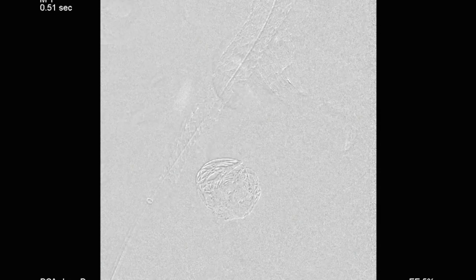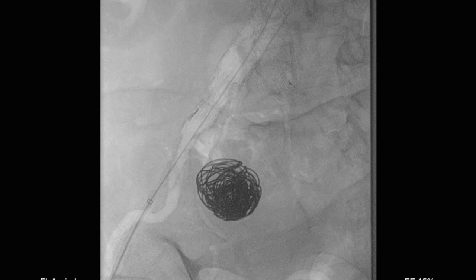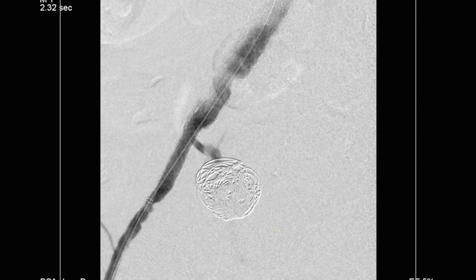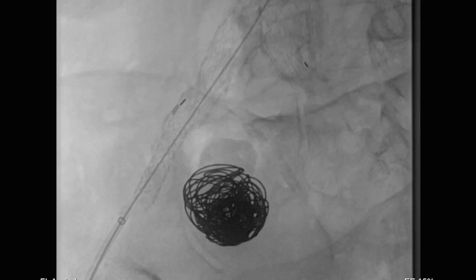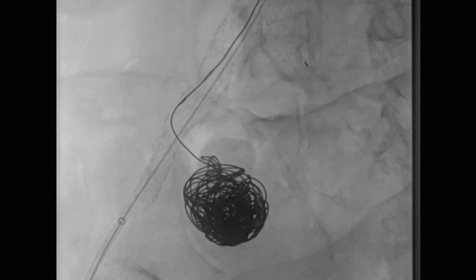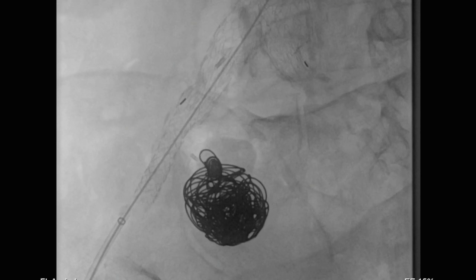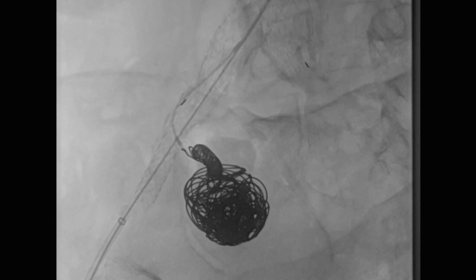Now we've trapped the catheter and we're packing more coils in here. More coils in — we can see the branch is still there. We're going to pull the catheter back just a little bit, and the key is not pulling the whole catheter out. More coils — pulling the catheter back, trying to get them prolapsing up into the orifice of the internal iliac. We need another coil in there. Remember, it's always the last coil that gets you in trouble.